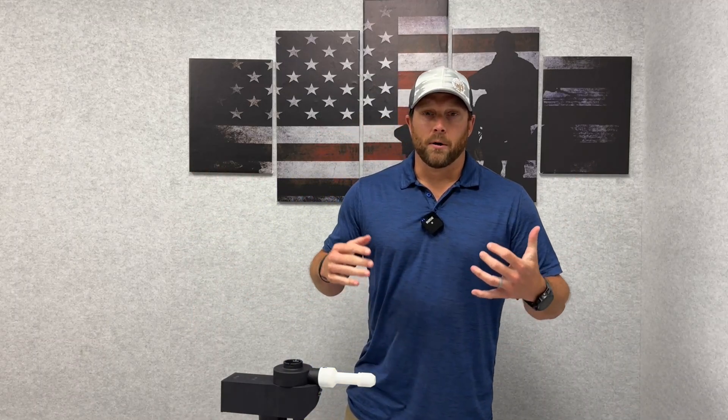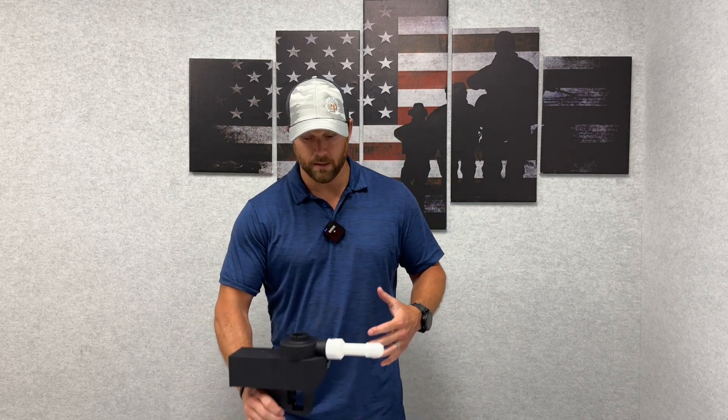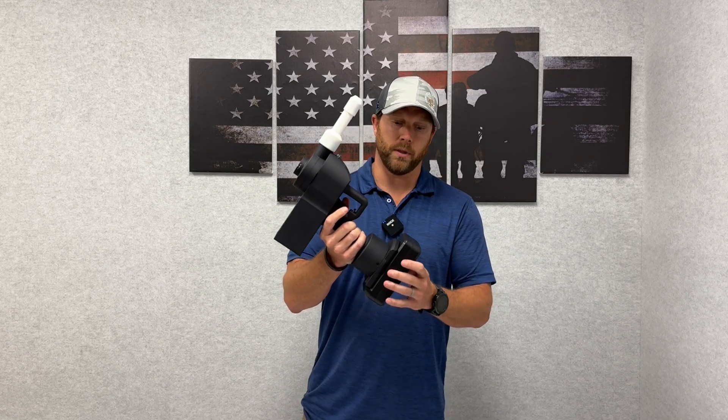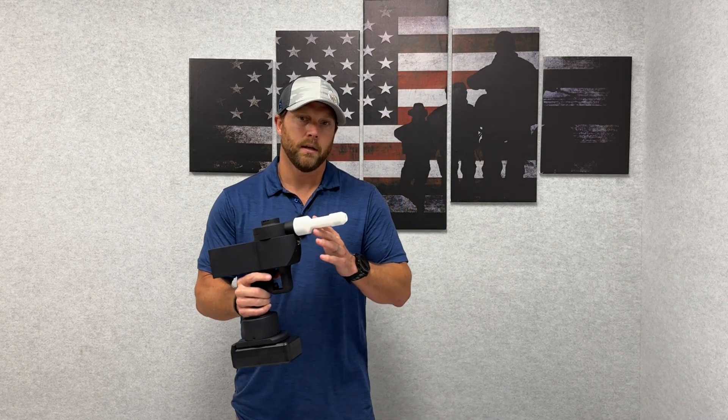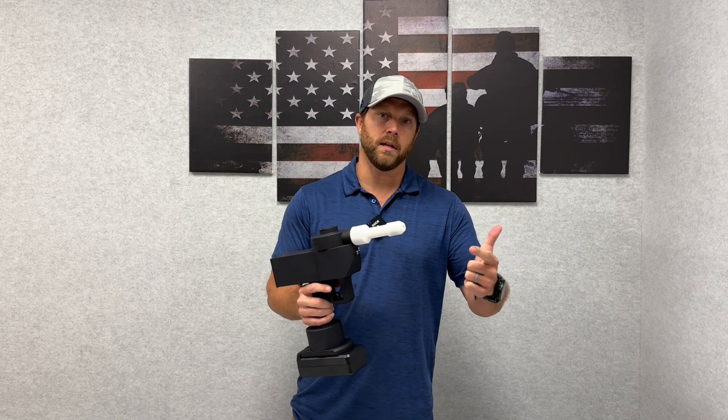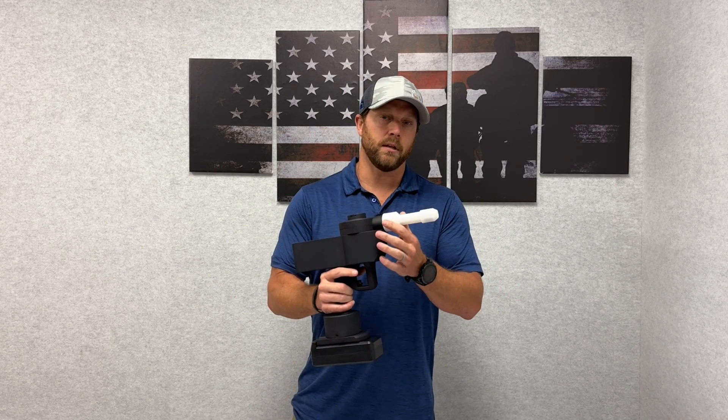Hey, how you doing? Sean here again with MapBot, but today I'm actually going to talk about one of our subsidiaries called Acessoplasma. Acesso is the Greek god of healing, and this is one of the products within Acesso — a handheld device that not only can disinfect and decontaminate, but also increase the healing rate on a patient.